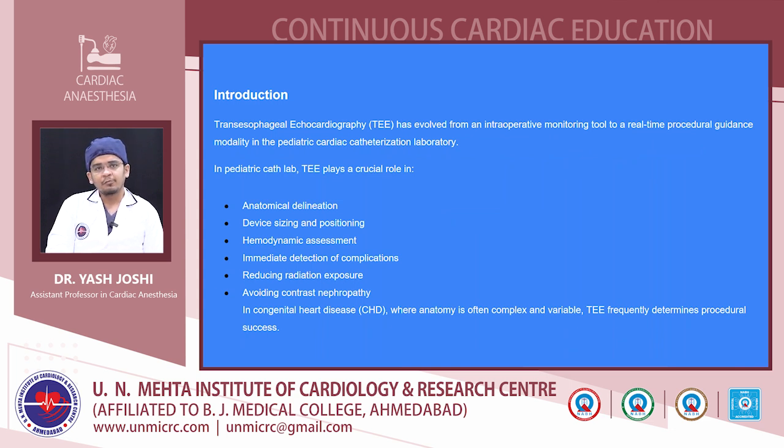As we all know, transesophageal echography has evolved from an intraoperative monitoring tool to real-time procedural guidance. In the pediatric cath lab, it plays a crucial role to delineate certain specific anatomy, to size the proper device and its proper positioning, hemodynamic assessment, and any intra-procedural complications. It also reduces the radiation and avoids unnecessary extra contrast. As in congenital heart diseases, where the anatomy is often complex and variable, TEE frequently determines the procedural success.